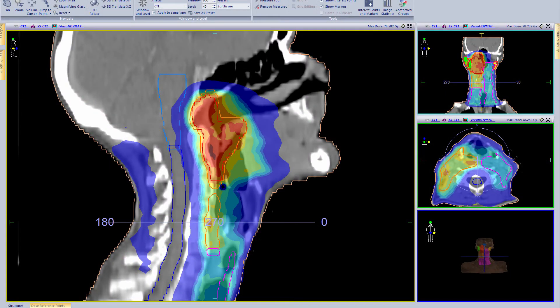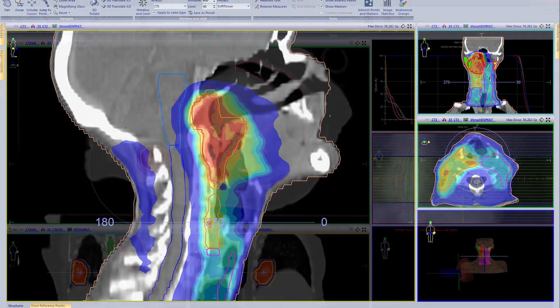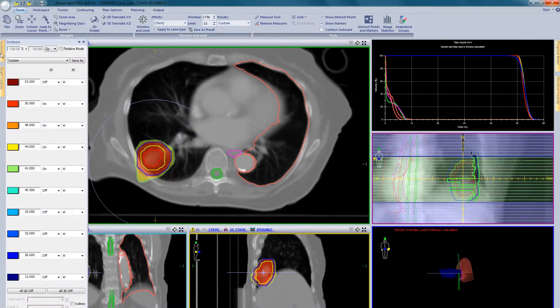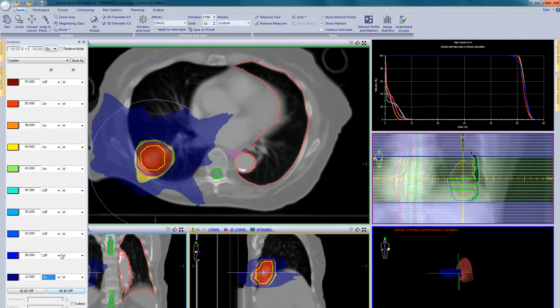Critical structure avoidance can be helpful in cases where a critical structure is close to the high dose region. In these cases, the patient's outcome could be impacted if the critical structure received a higher dose than was planned. In Monaco, individual isodose lines can be converted into structures and exported with all other selected structures into XVI. Isodose structures in XVI can be a quick visual check to determine if the critical structure is closer to the high dose region than during planning.